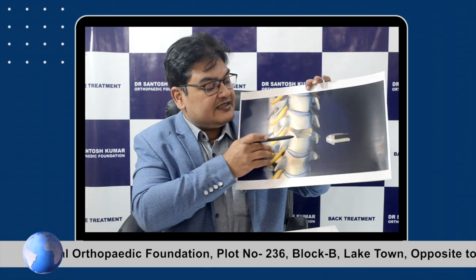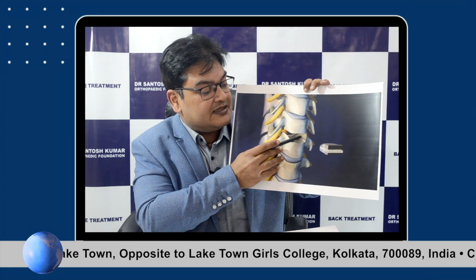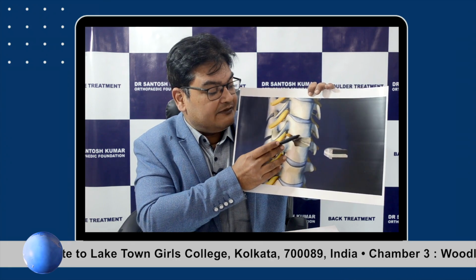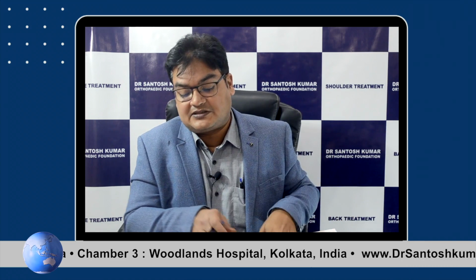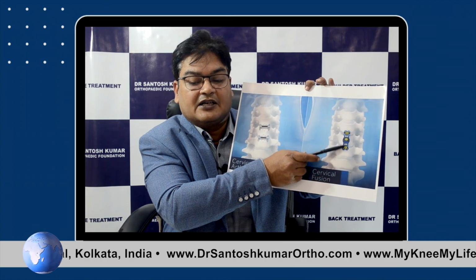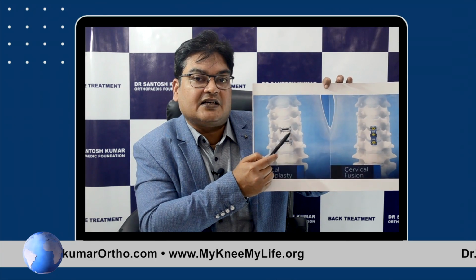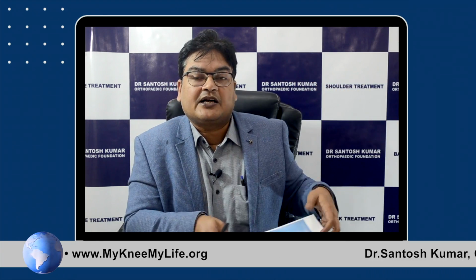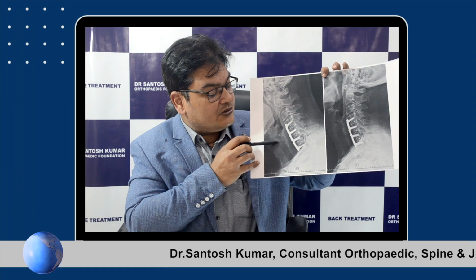Most of the times this affected disc is removed, and we have 2 options. One is to fuse it, which means we remove the diseased disc, we decompress the nerve root, and then we put a spacer and filler and we fuse it. And the second option is we replace it, which is known as disc arthroplasty. We remove the diseased disc and put an artificial disc there. Putting an artificial disc is disc arthroplasty. Now this is how it looks in X-ray.